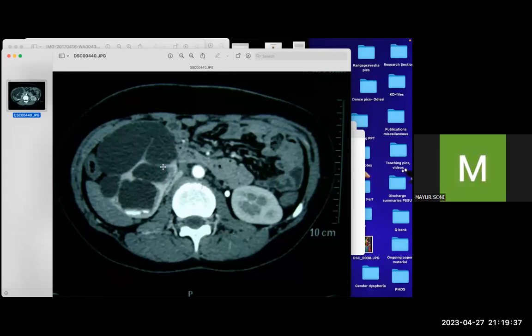Six months? Polycystic. It can be an MCDK, but again, you won't have this. Okay, MCDK are smaller masses, but it is possible, sir. That one odd mass is a large mass, and septae may or may not be there. That's possible. It is still commensurate with that. What else?